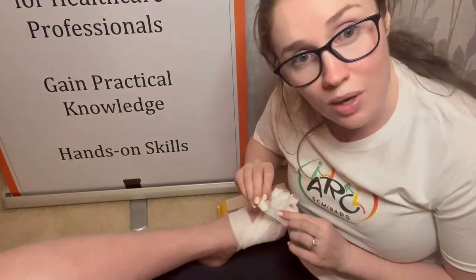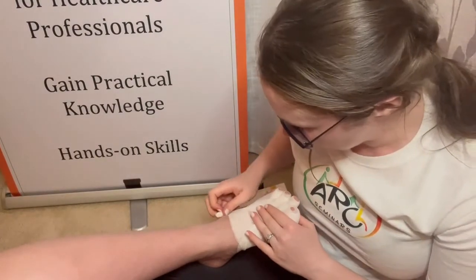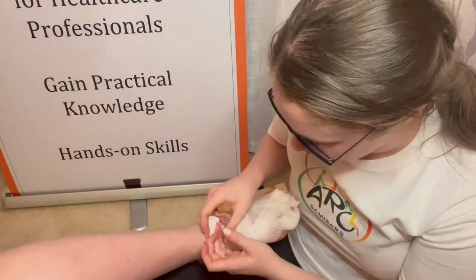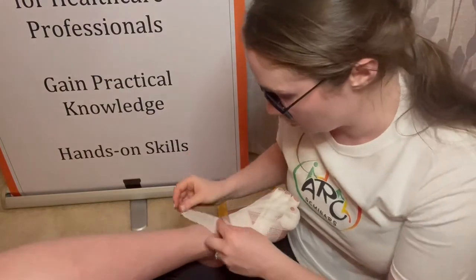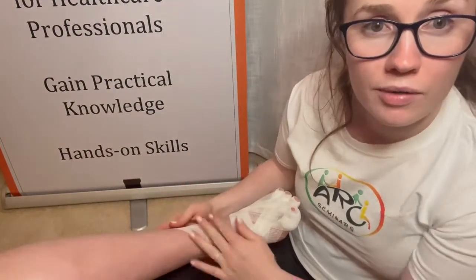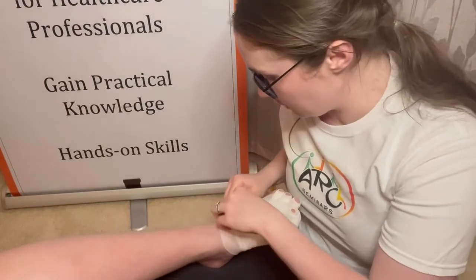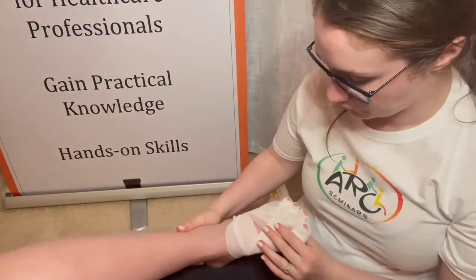So make sure that you have enough gauze left that you have an anchor. And as you go around the toe, the foot the final time, you should have enough gauze left that it is not going to finish here and slip out under the patient's wrap. At this point, I either stick it to the liner that has been in place, or I can tuck it in to itself like so, or use tape to stick it down.